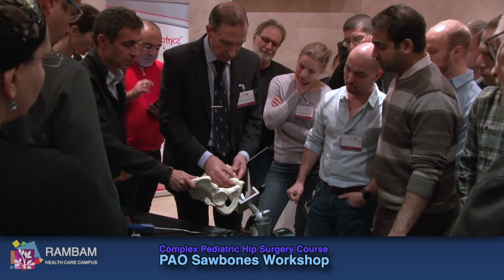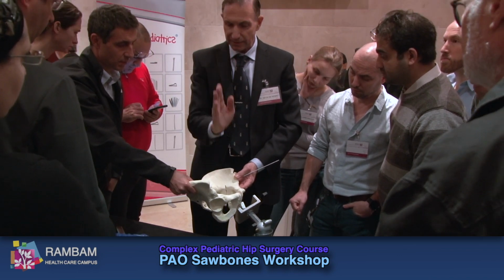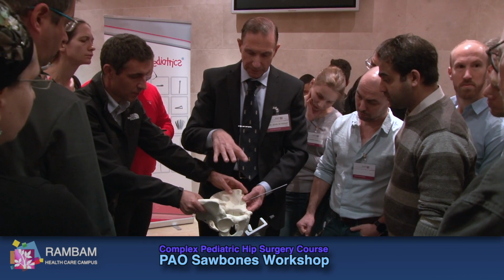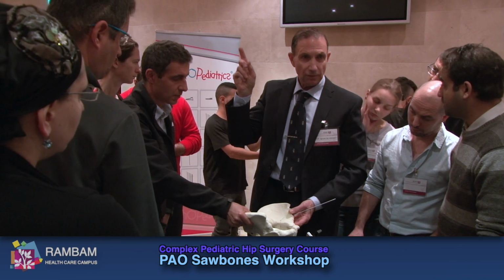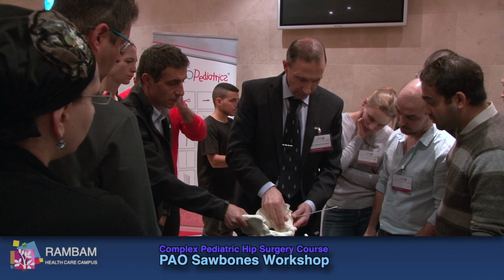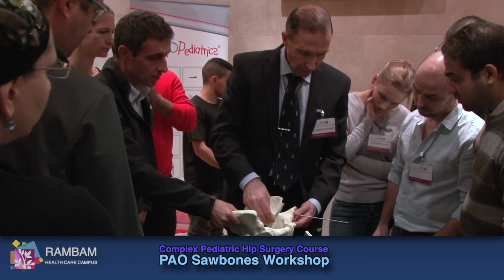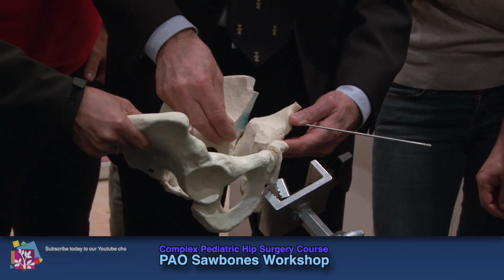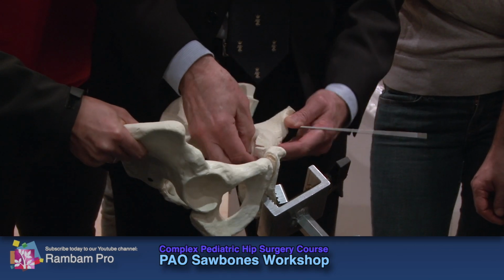I always put it back in position. I repeat them 2 or 3 times. I make sure my X-ray machine is exactly the same position as set up beforehand. The picture I'm getting, in terms of what I'm seeing here, is the same on my X-ray, my plan. Right? So if I want to correct it to that, I need to see the same picture. I do that maneuver. That maneuver. Then I uncover the anterior rim. Right? And then I'll make sure I've medialized the fragment. The teardrop comes up. Can you see the teardrop coming up?